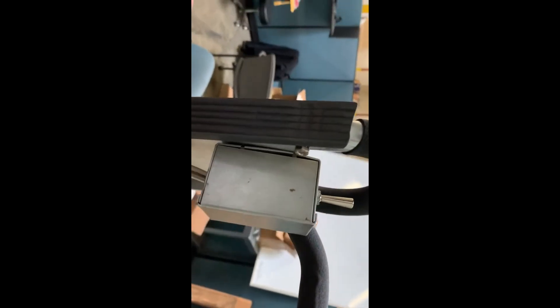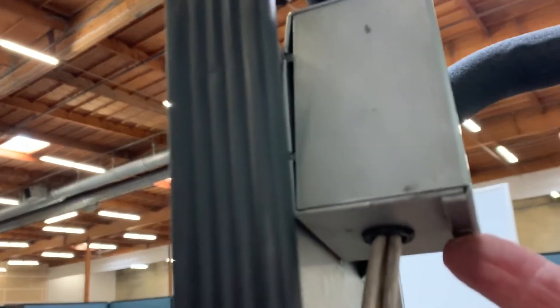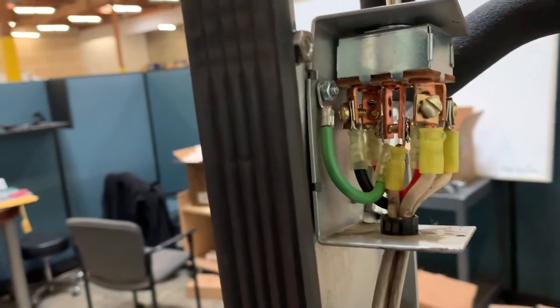The first one we're going to do today is replace the toggle switch — I'll show you how to do that. The first thing to do is remove these screws. You've got one here and one underneath right here. So those two screws need to be removed. With the screws removed, you just remove the cover and there's your switch.